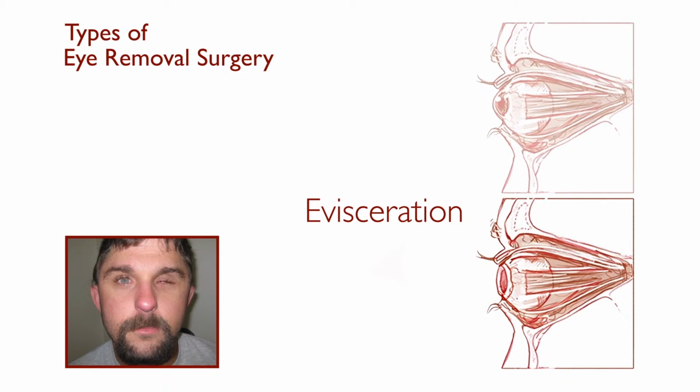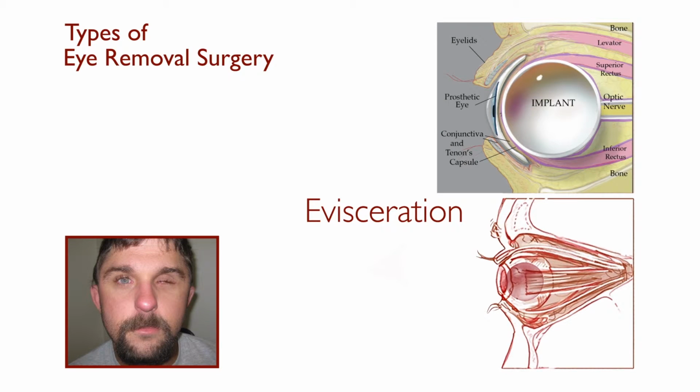To replace the size and weight of the contents, a ball-shaped plastic implant is placed inside the scleral sac. The selected size is as large as possible, allowing for closure over the front. The white sclera forms a tough covering to the implant, which is placed inside before the sclera is sewn tight, and it moves almost as well as before, moving with the other unaffected eye. Without touching the other orbital tissues, evisceration often allows faster healing. The implant moves well with the other eye, and the total volume of tissue in the orbit remains nearly the same. Only the inside is taken away.